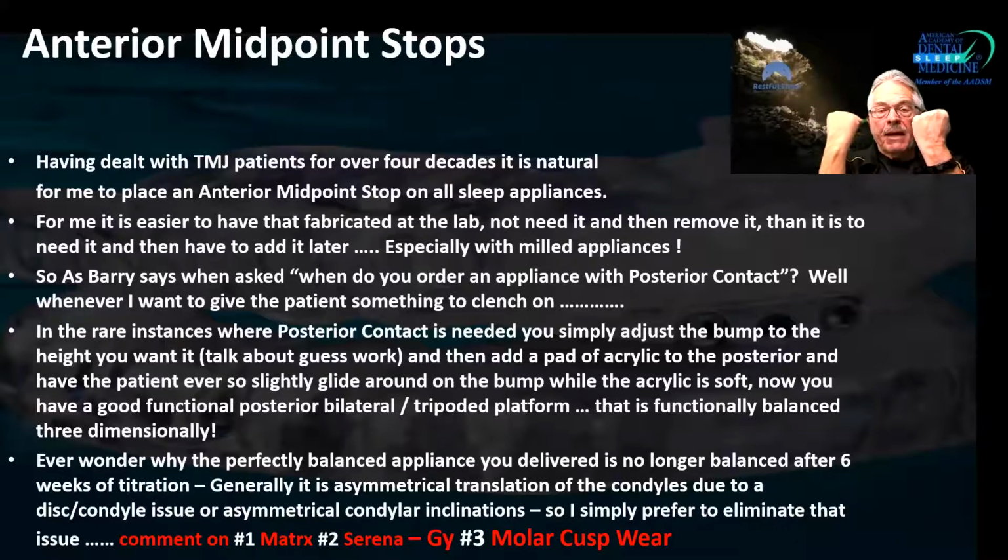And let's say that you take the bite registration where the condyles have rotated a little bit, and actually not really how that occurs, because when you take an open bite registration, whether it's for a night guard or for a sleep appliance, that is mostly just taking the mandible, instead of opening it like this, you're opening it like this, okay?